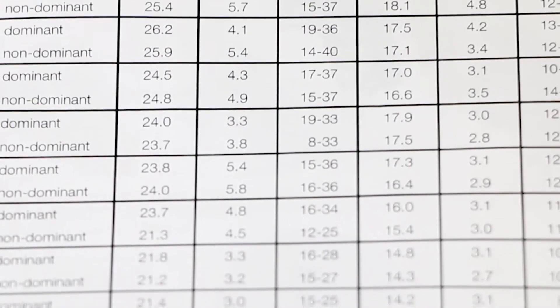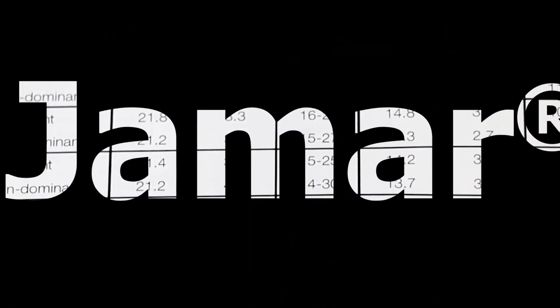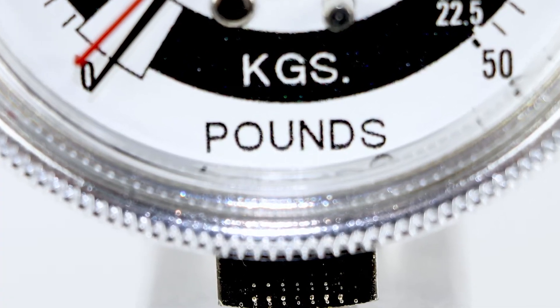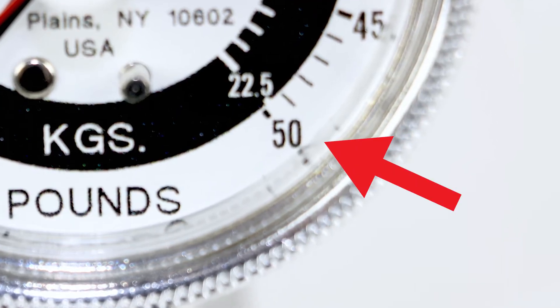In a research setting, the results of the baseline pinch gauge are consistent with the Jamar research studies. It displays readings in either pounds or kilograms and has a maximum capacity of 50 pounds or 22.5 kilograms.